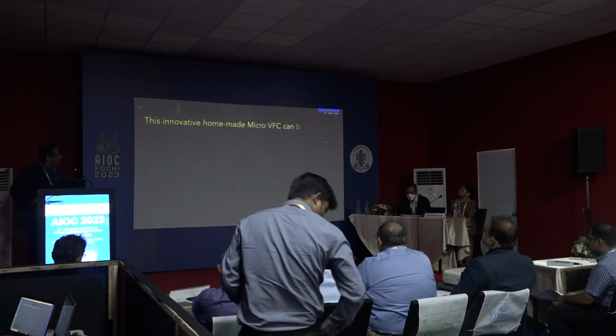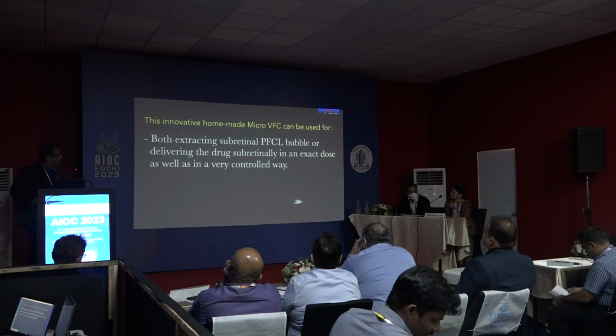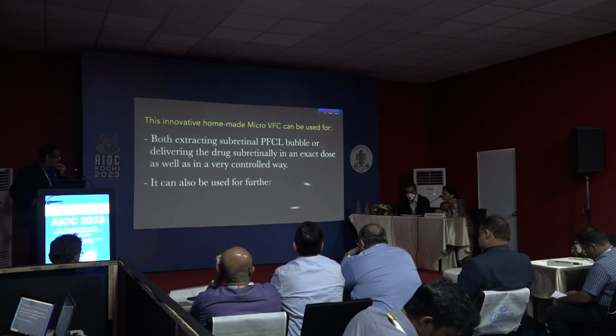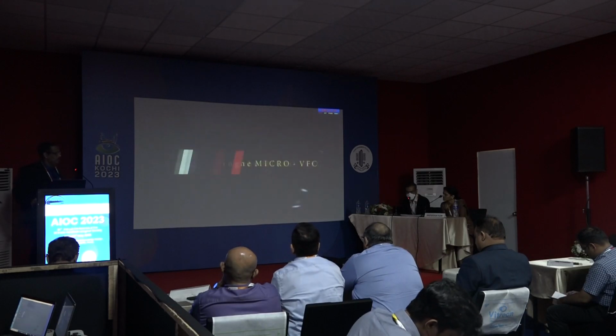So this indigenous micro VFC can be used for both extracting subretinal PFCL bubbles or delivering the drug subretinally in an exact dose as well as in a very controlled way. It can also be used for further transduction of subretinal gene therapy. Thank you.